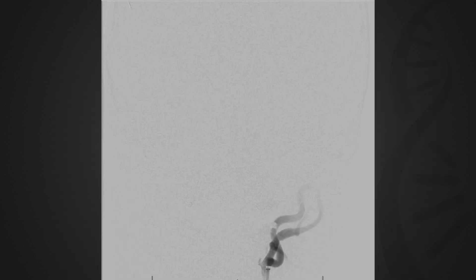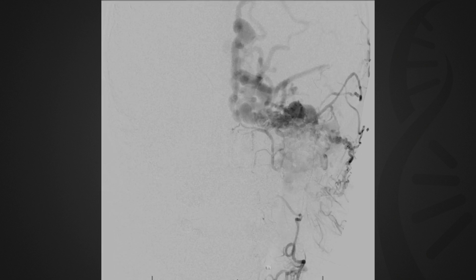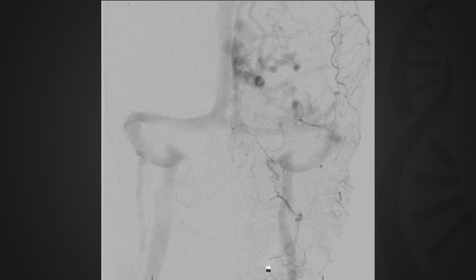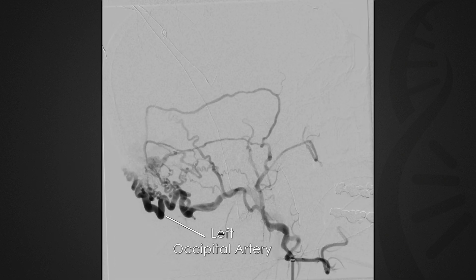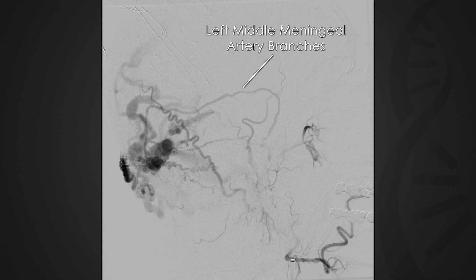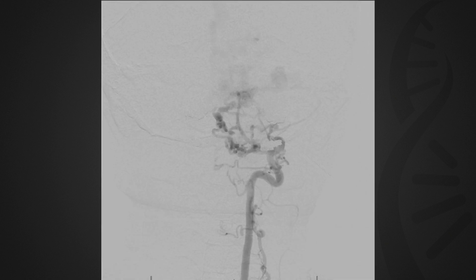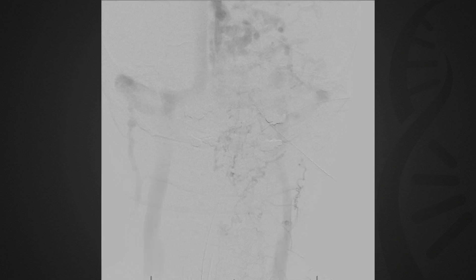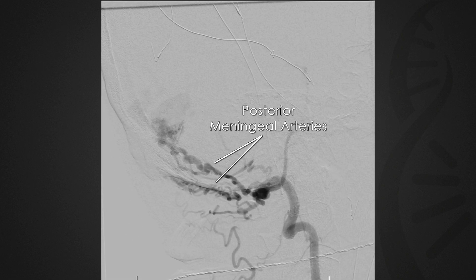Diagnostic cerebral arteriogram showed a complex dural arteriovenous fistula with multiple feeding vessels from the left external carotid artery, including branches off of the left occipital artery and middle meningeal artery. There was also supply to the fistula from the posterior circulation from hypertrophic posterior meningeal arteries arising from the bilateral vertebral arteries.